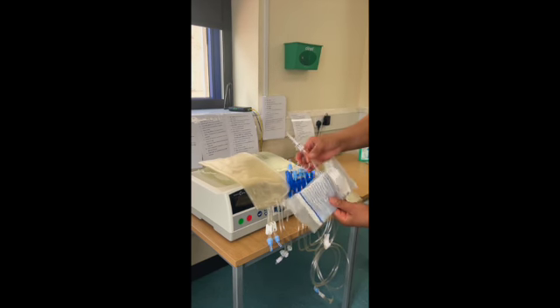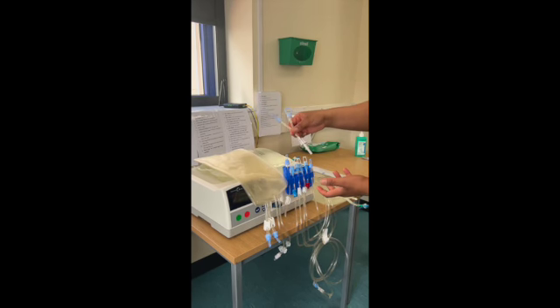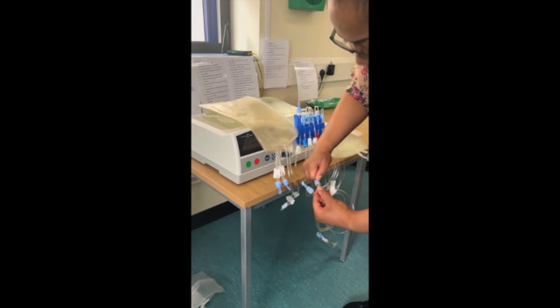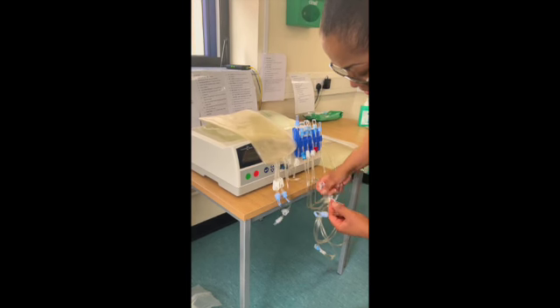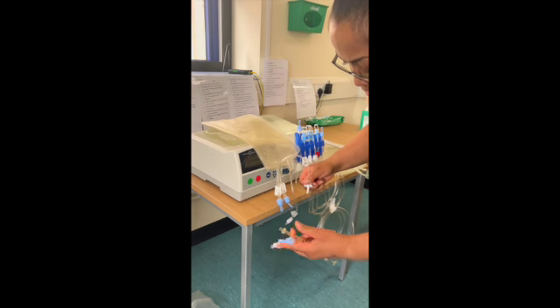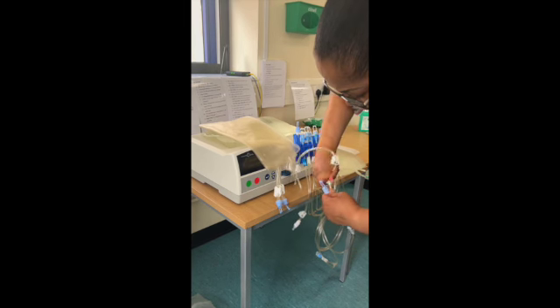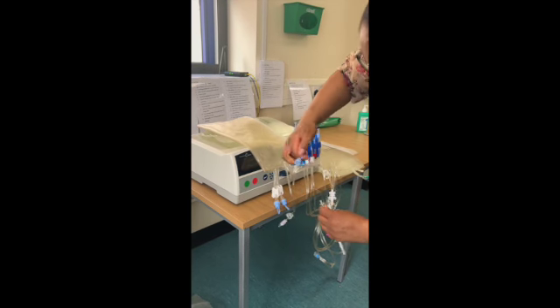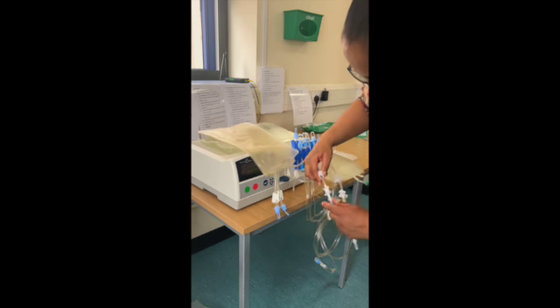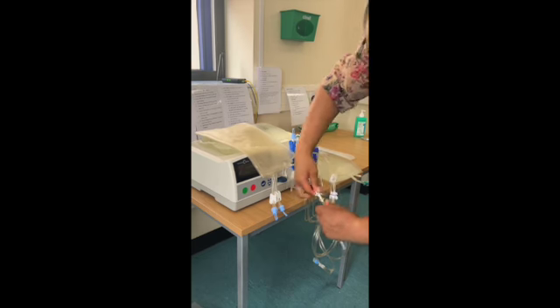Now I've got to be really careful that I don't touch any of the stuff that connects in. Don't want any infection. So now I'm going to connect them, and I've got to be really careful that I don't touch these parts. And make sure that it's pushed all the way in. Think salt and pepper. If you get the reference, you get the reference. And that pushes again there too.